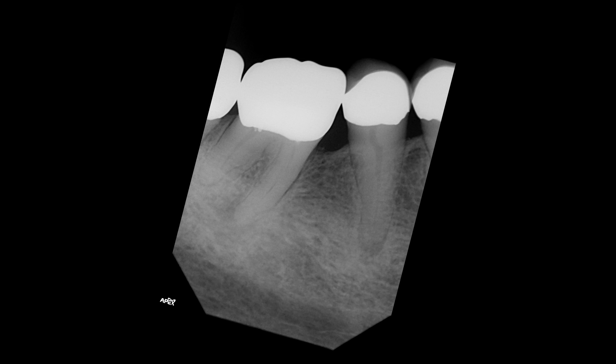This is a patient that came in for pain on the lower right, lesions on the 4.5 and the 4.7. The 4.6 was extracted a long time ago, so we're going to endo both of these teeth, but before we do that we're going to give a mandibular nerve block. The original audio is going to be there, so we're going to listen to that and then I'll explain in increments as we go along.